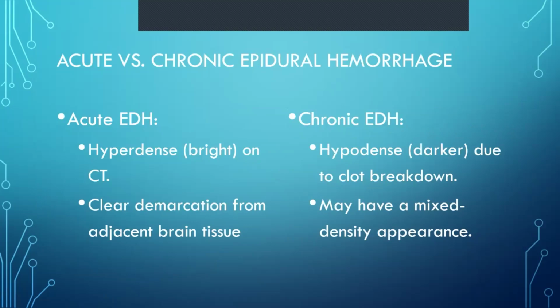Because very often, even us as seniors, we often get CT scans sent to us, and the person says, this person has a bleed, there's something very wrong, and when we look at it, we can say, but this looks chronic. And I do feel sorry for the juniors sometimes, because we don't often teach you the difference between what's an acute and a chronic. So hopefully you'll be able to pick it up here.